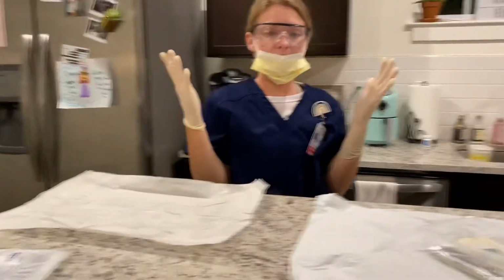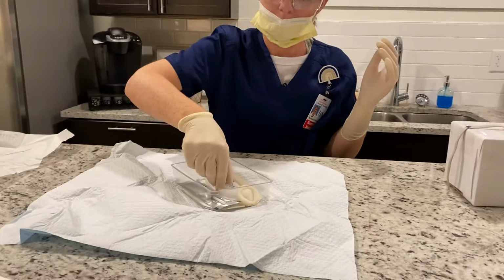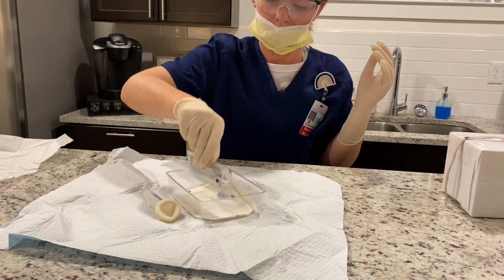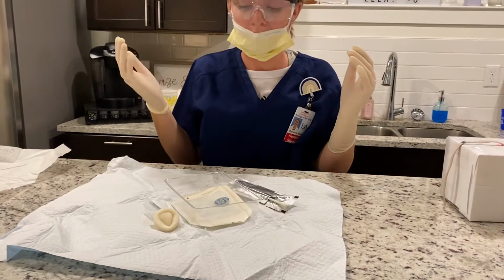So I'm going to keep my hands above my waist, and I'm going to organize my sterile field and make sure everything stays away from the 1-inch border.